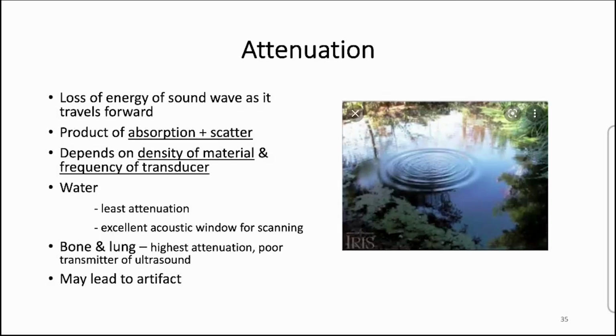Absorption, scattering and reflection are not important here. But artifact, you know that air is a very poor medium for the transmission of sound wave. As we know, the lung alveoli are full of air, which is a very poor medium for the transmission of sound wave. When there is any pathology like pleural effusion, consolidation or mass, artifacts help us to delineate and diagnose a pathology.